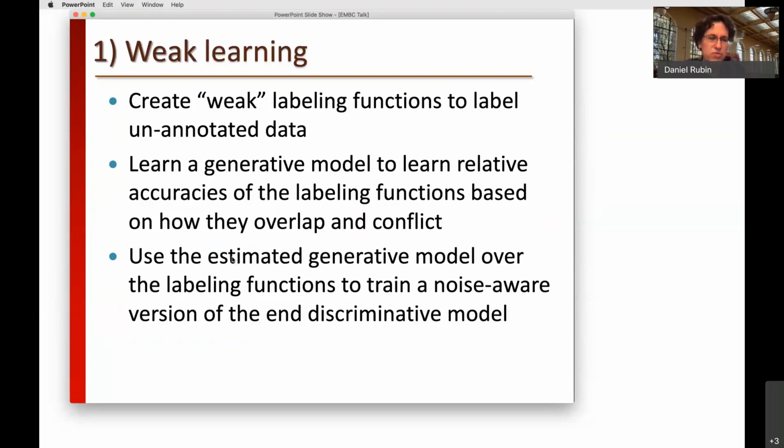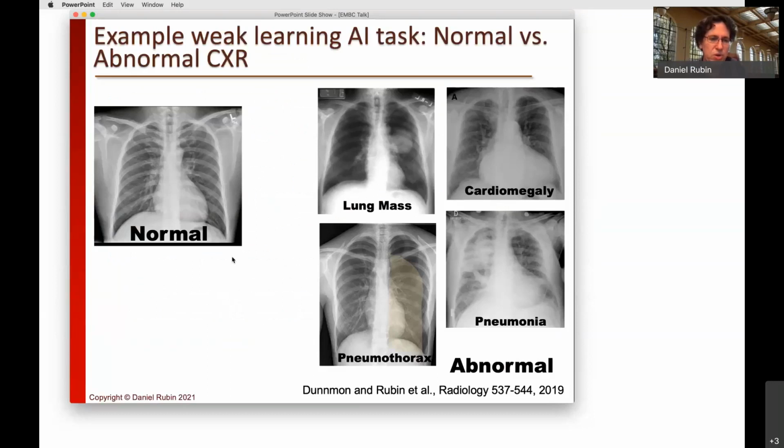But once you do that, then you can build a model on top of those weak labels. First, you could clean the weakness in the weak labels by looking at discrepancies in labels, and that's done by making a generative model, and then using that to produce final labels. Still, the labels are weak, but it's just to show you the power of this at large scale.